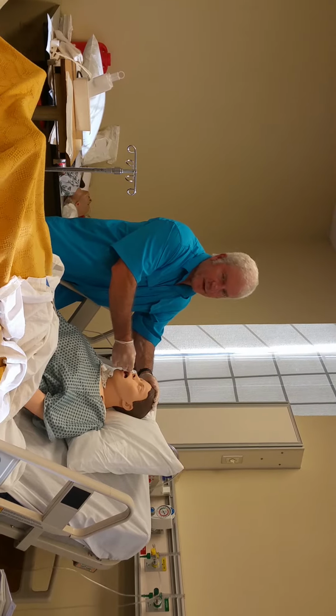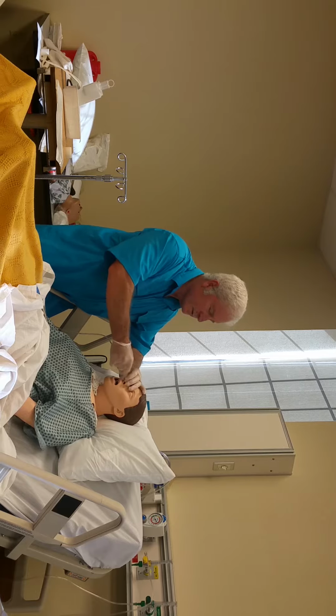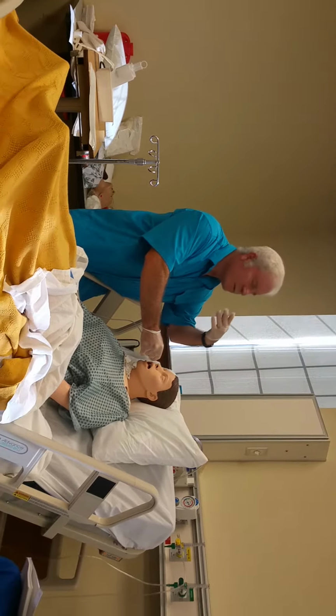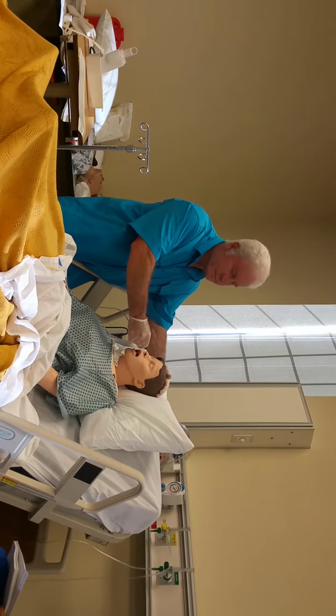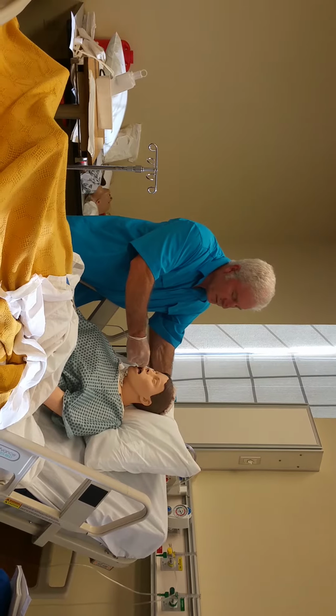It's already dead stopped right there. That's as far as I'm gonna be able to put it. But I'm gonna pretend I'm past the turbinate, okay? I'm gonna say, and he's gonna go, oh, his eyes are gonna be watering. It's not comfortable, okay? So I'm gonna say, okay, now we need to tilt your head forward.